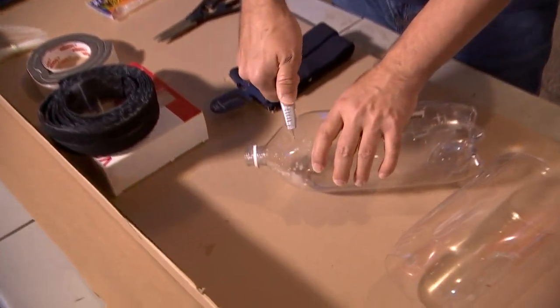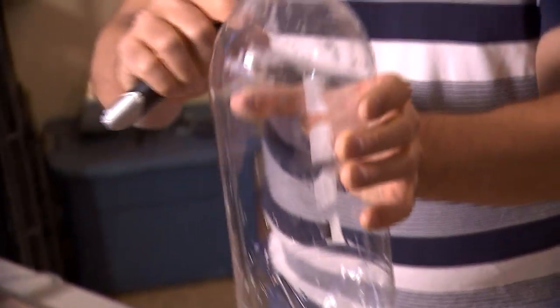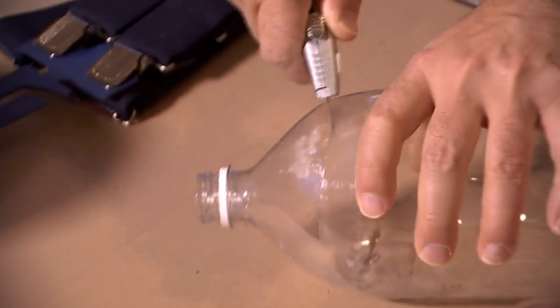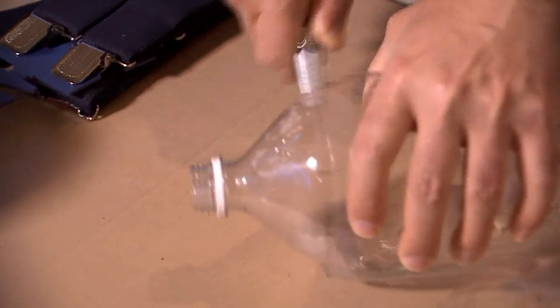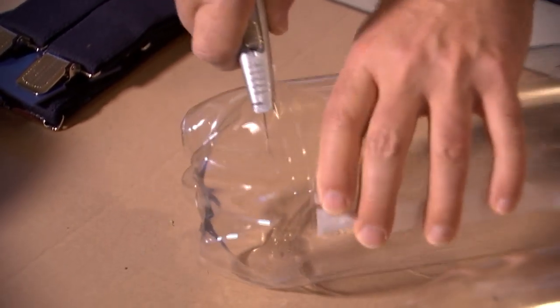We're going to take a knife and cut the bottle. On the lip, you want to leave that arc to come around a little bit — that's going to wrap around the medical professional's face. Cut that right off, all the way around. Then do the same thing all the way at the bottom of the bottle, cut it all the way around, and that's going to leave you with that.